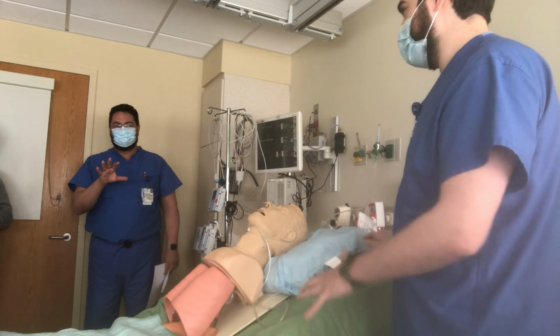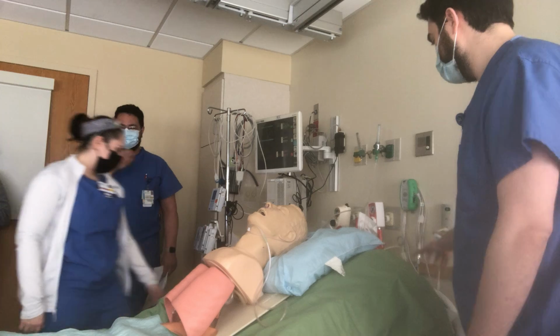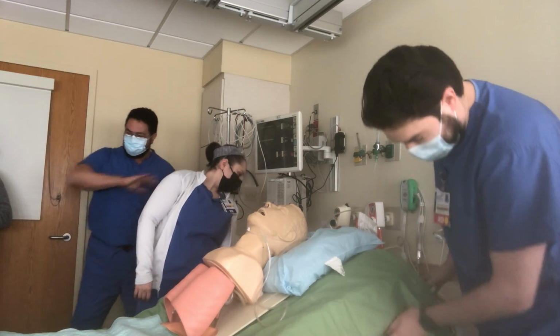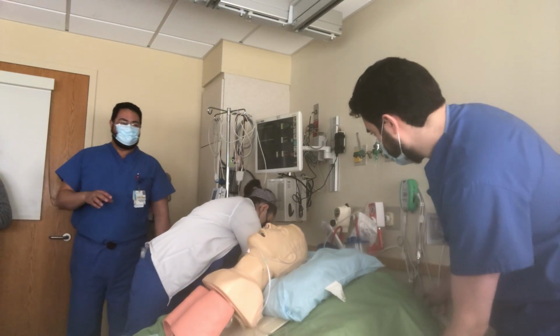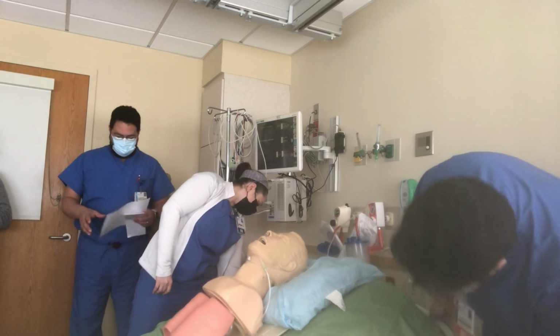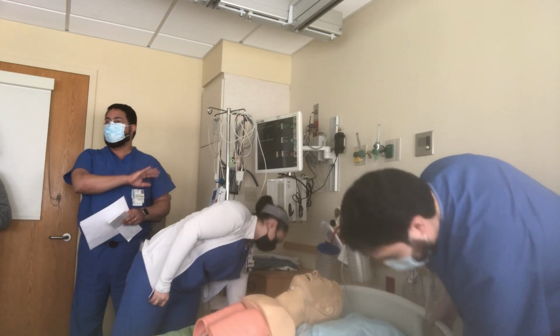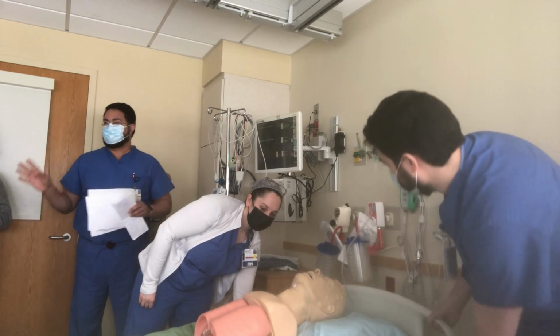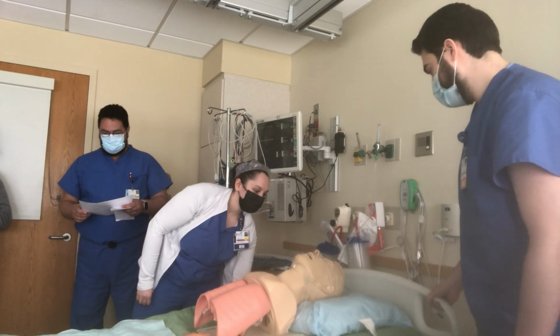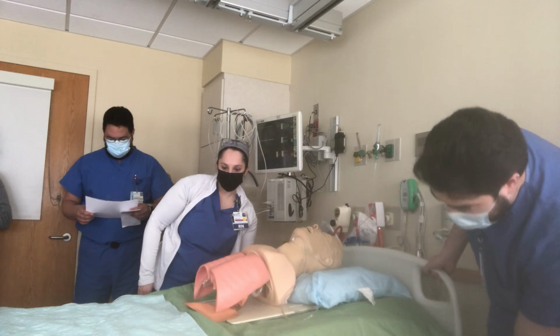Simple. Head down, and something else with the bed. Pull the bed away from the wall. The head down, and pull the bed away from the wall, because you can't imagine the frustration of somebody coming in and you can't get behind the bed. Happens in every code. So yes, we'll move the bed down so somebody can stand behind the patient.